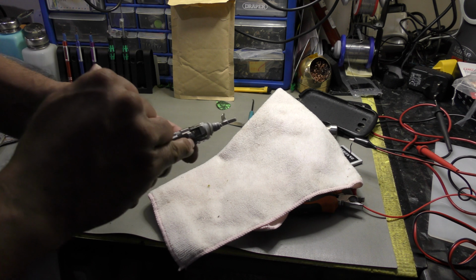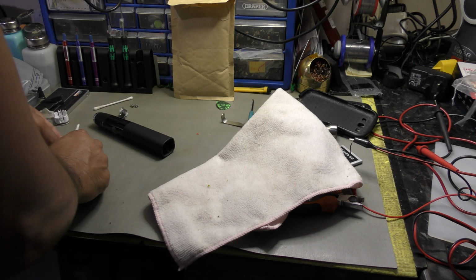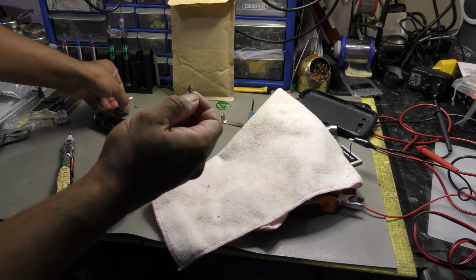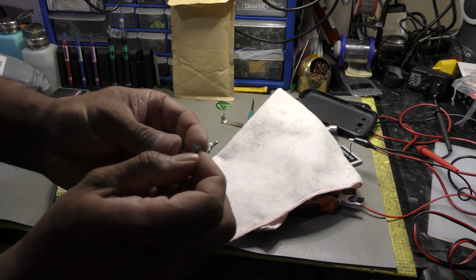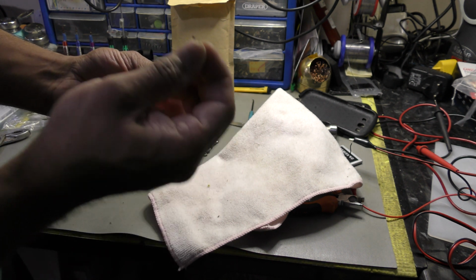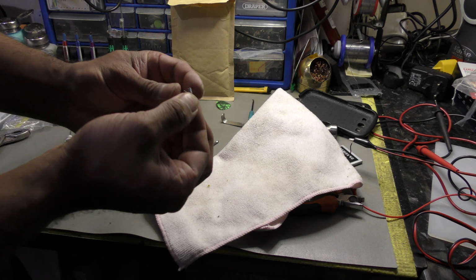Once that's done, just unscrew this screw. Just remember the orientation of the clips and everything. Unscrew it, take it out. What you will have then is this. This will come out. That's the internal part. Okay, this will come out. Okay, this little clip, I hope you can see this. Okay, the screw will come out. The screw is non-magnetic, just remember that. So you will have to use your hand or your pliers to pinch it out if it doesn't come out all by itself.